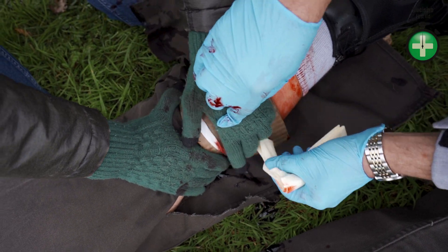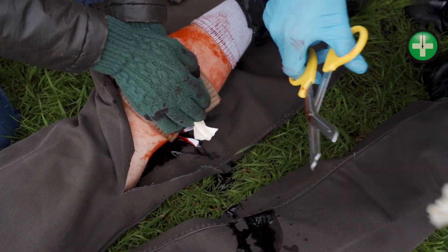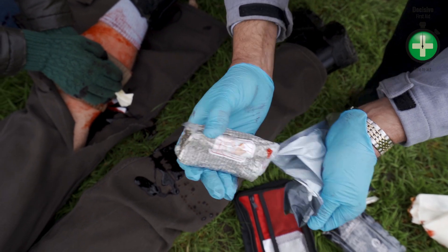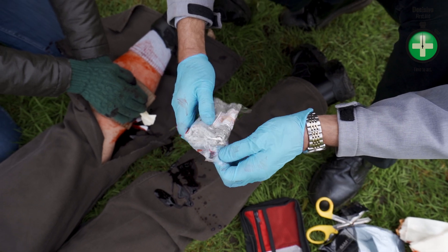Direct pressure back on top of that wound. I'm now stepping back so you can get the dressing on. I've opened out a layer of the dressing.